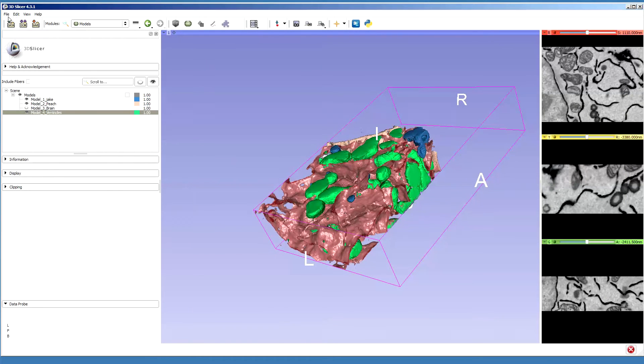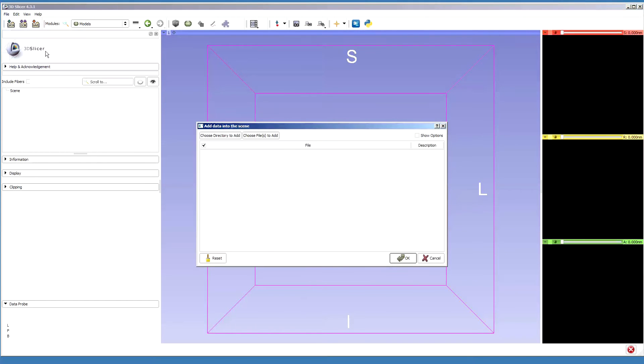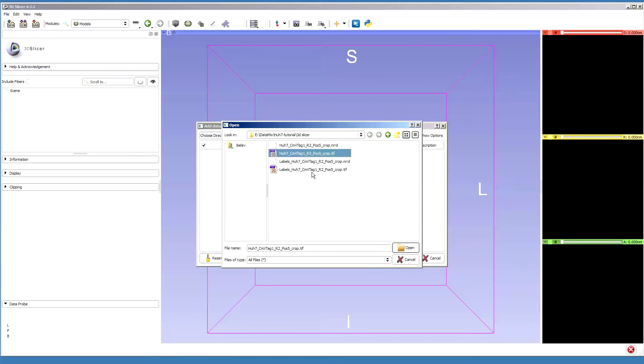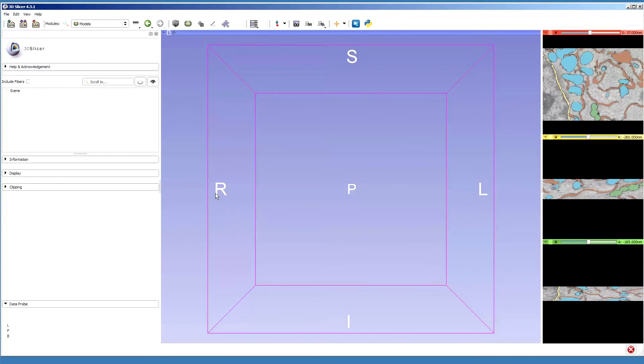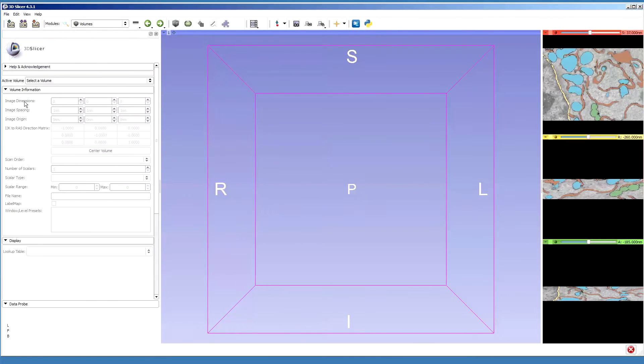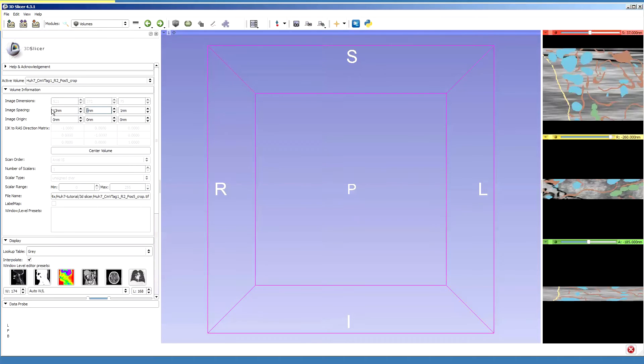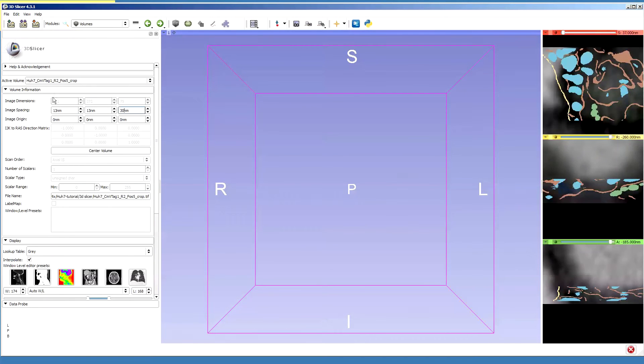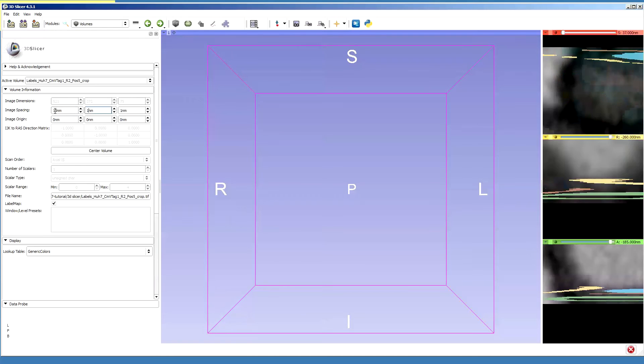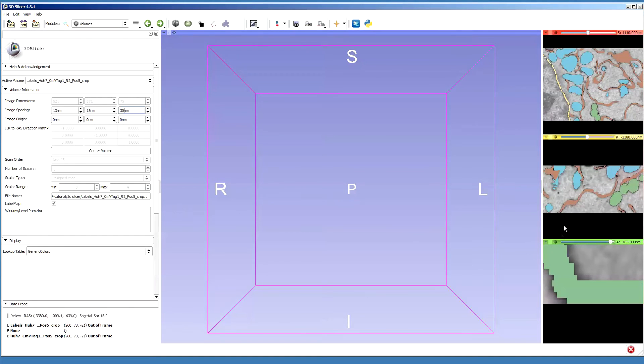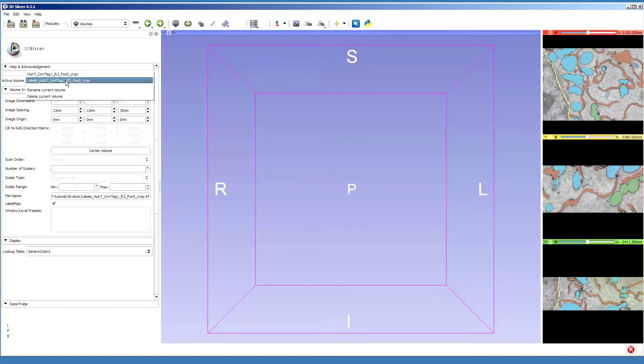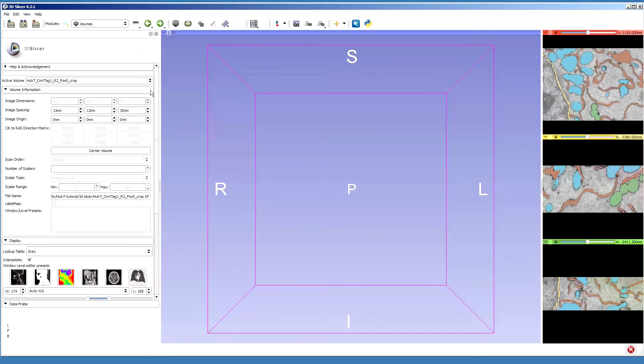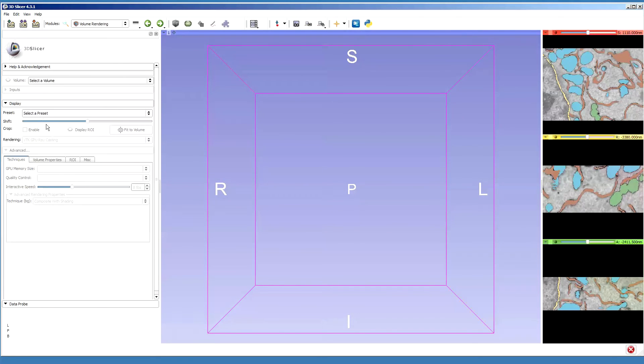Then I go back to 3D Slicer. I will close the current scene and then select the datasets, which are these two TIFF files. Now they are opened, but I need to place the proper parameters first for the voxels. They were 13, 13, 13 and 30, and the same for labels. Then I'll fit to view and make sure that the label map switches on. After that, these are the two volumes I have, and I can visualize them using volume rendering and segment the models out.